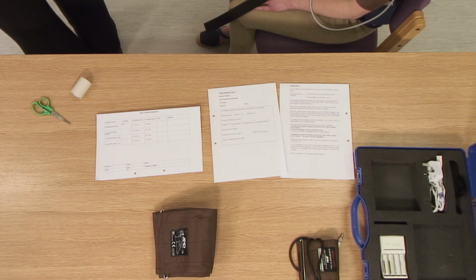Please complete the loaner form so the Oxford monitoring team can track which piece of equipment has been issued, and complete the patient details, including contact address and telephone number.